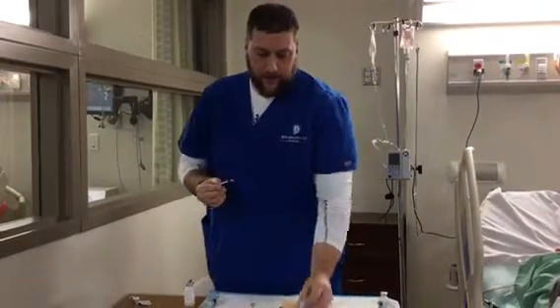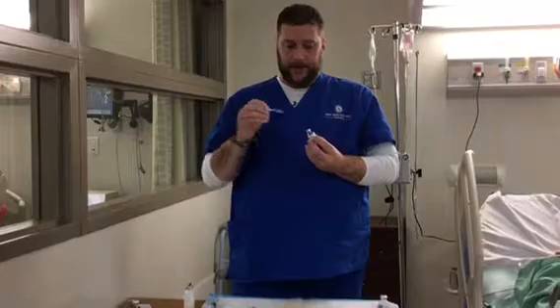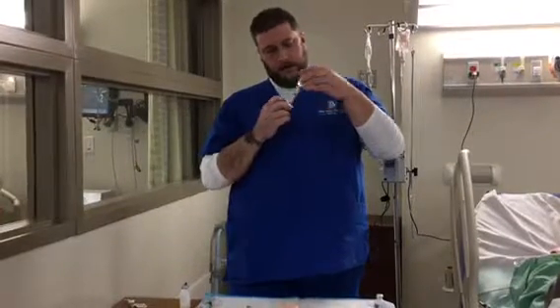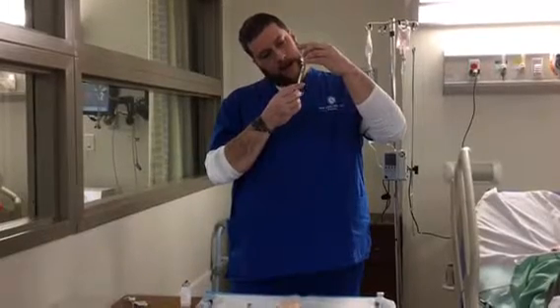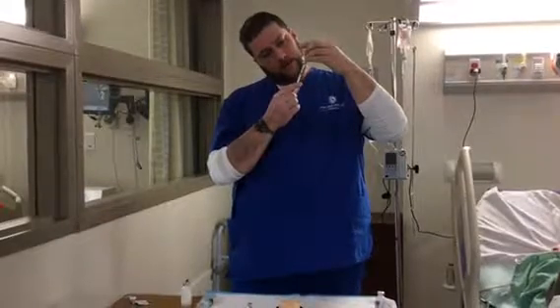At this point, if you're a little bit off and you do have air, you can expel it since the medication is not yet mixed. So I'm a little over 10, so I'm going to go to 10. Now I would do the cloudy. Once the cloudy is withdrawn, you cannot redo it. If you go over or under, you need to start over again. So at my 10 units, I'm going to insert, being careful not to get any air. I'm going to add 10 units, which brings me to 20.